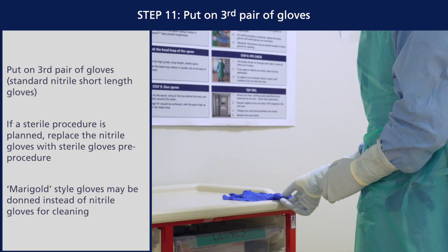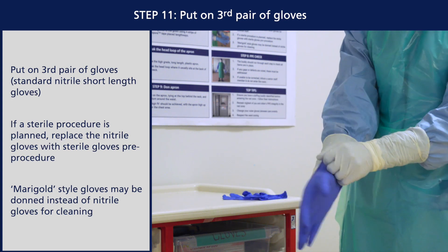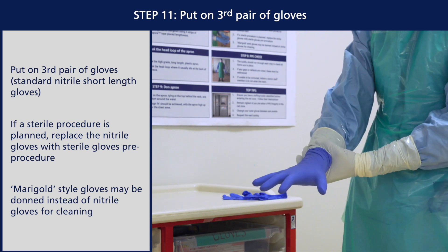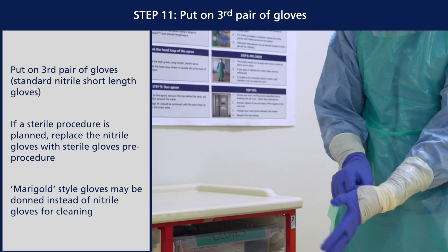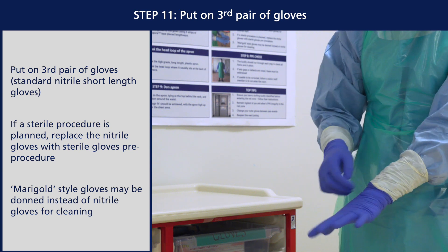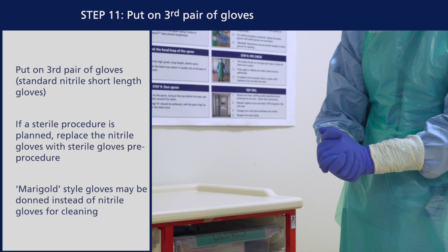Put on your third pair of gloves. These are standard length nitrile gloves. Whilst it is not possible to wash hands or use alcohol gel in the red zone, this outer pair of gloves can be changed as needed if hands become contaminated. If a sterile procedure is planned, replace the nitrile gloves with sterile gloves pre-procedure. Thicker, marigold style gloves may be donned instead of nitrile gloves for cleaning.